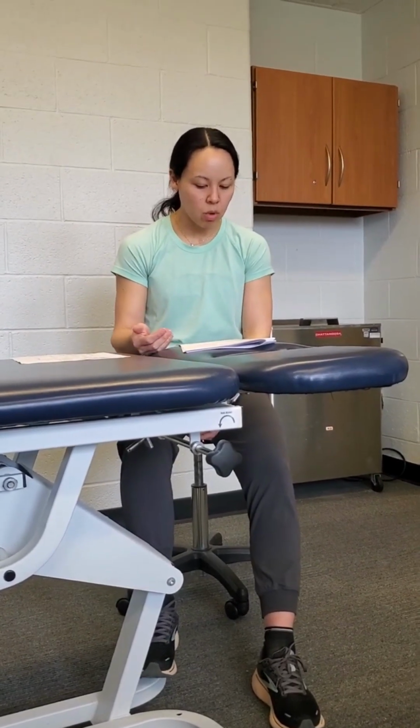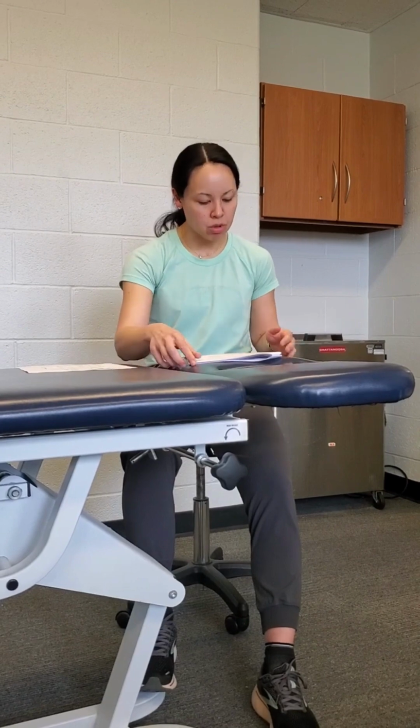Resistance, you can do single joint, multi-joint. So single joint would be your knee extension machine, versus multi-joint having them do a squat or a lunge while they have the cuff on. And then for passive, it's really just like ischemic preconditioning, and it's muscle sparing. We're not really trying to build muscle at that stage. We're trying to reduce the muscle atrophy that's occurring after their surgery.